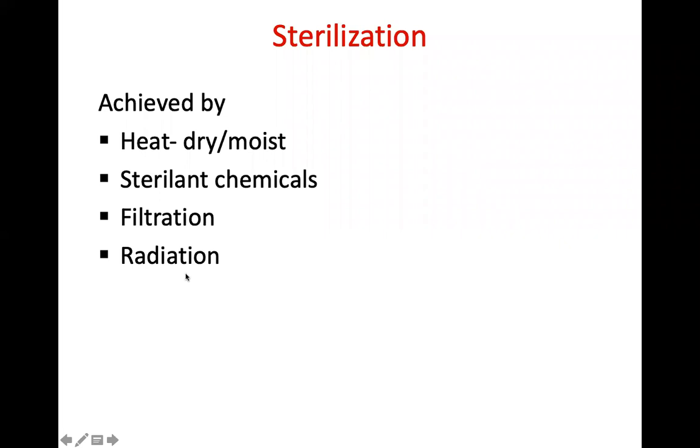For some of these items in an industry, it is large scale. You are producing thousands of surgical blades per day. You cannot put them in small heat containers. So what is more feasible is to use a physical method like radiation, using gamma to sterilize large items, and then you seal them so that they come prepackaged, sealed, and marked sterile. So the choice of the method of sterilization that you'll use will be guided by some of those factors that I have mentioned, okay?